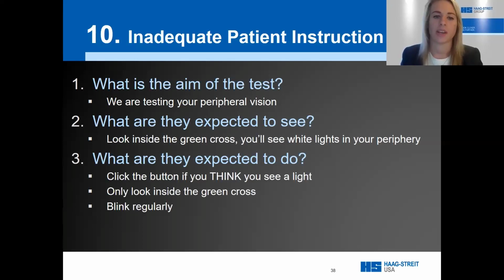What are they expected to do? As soon as you think you see a white flash, click the patient response button. Don't look at the flash, only look inside the green cross. See how I mentioned that one twice? Blink regularly. If you think you missed a light while you blink, that's okay. The instrument knows that and will represent that light later on.